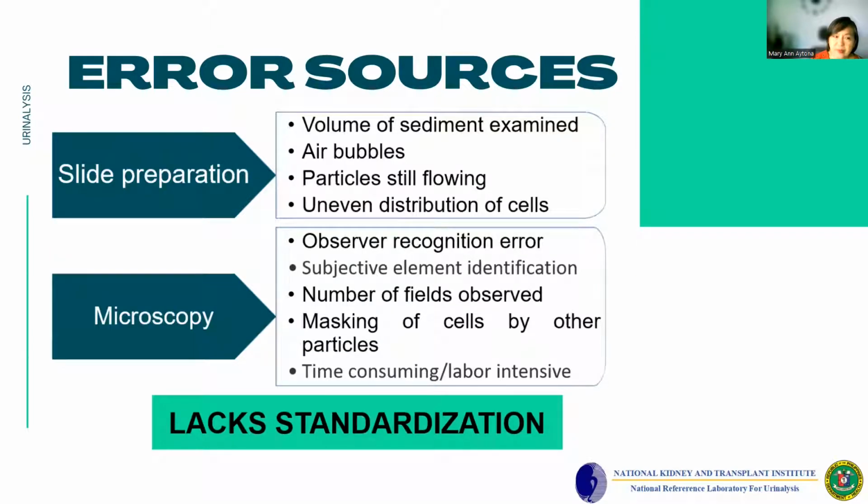While doing slide preparation: volume of sediment examined, air bubbles, particles still flowing, uneven distribution of cells. And while doing the microscopy: observer recognition error, subjective element identification, number of fields observed, masking of cells by other particles, time-consuming or labor-intensive. So it lacks standardization.